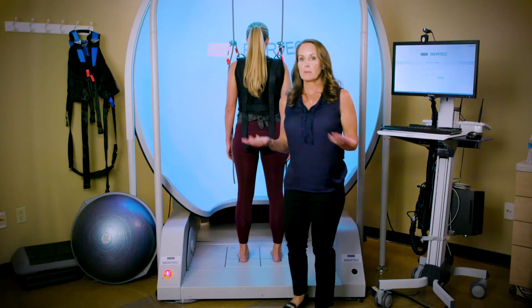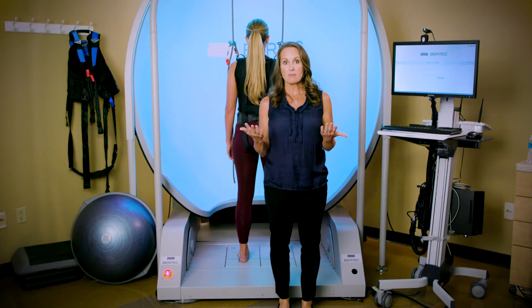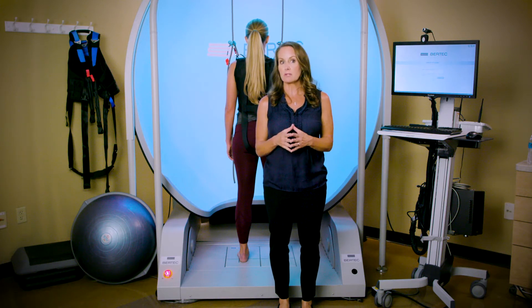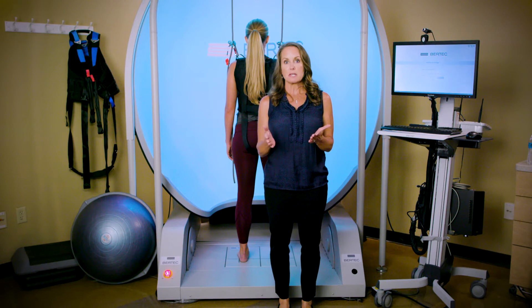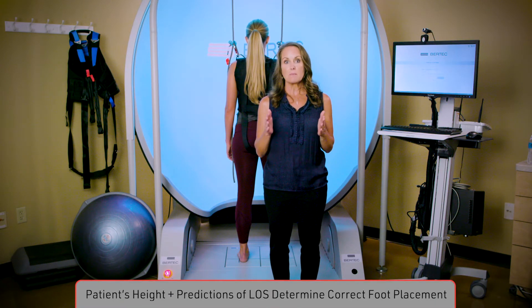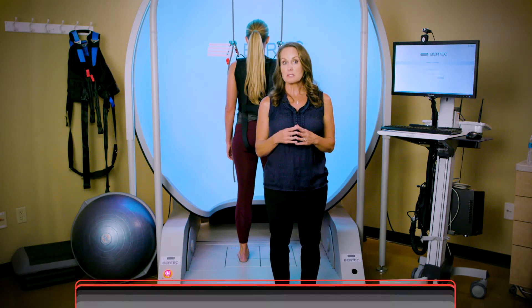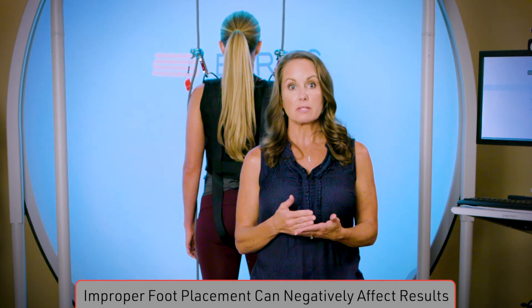Now I want to talk about the placement of the feet and the importance of that. It's very important to obtain an accurate measurement of center of gravity alignment when performing assessments. Accurate scoring requires that the feet are centered appropriately on each of the left and right sides of the force plate. The distance between the feet is calculated based on the patient's height and predictions of limits of stability, as discussed in the Foundations 101 course. Assessment results can be negatively affected if feet are not placed appropriately prior to testing.